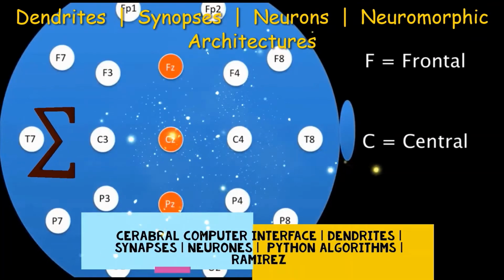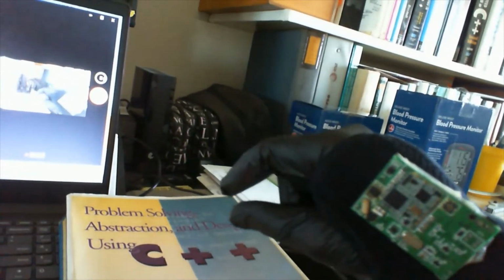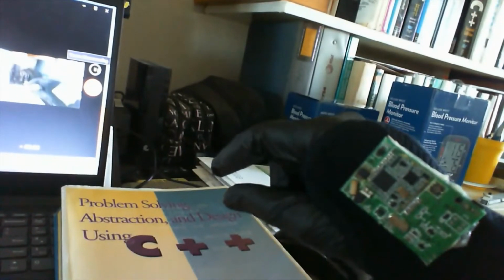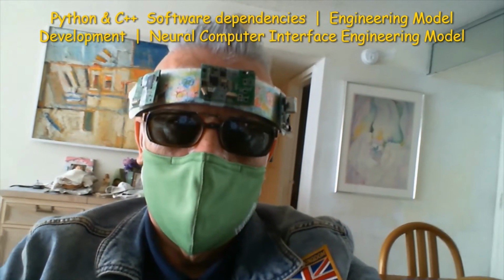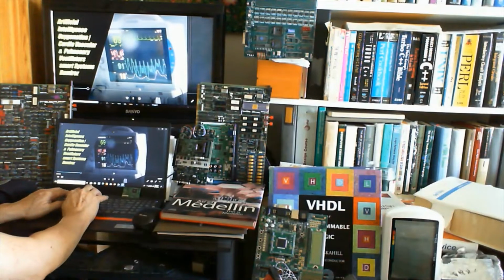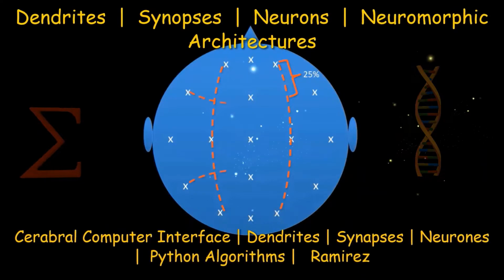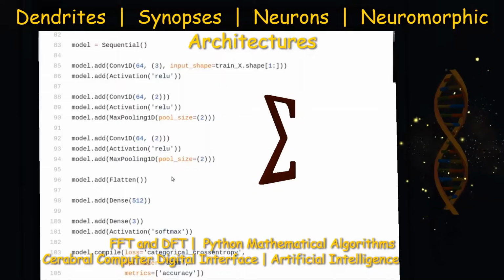To be precise, for a BCI that can recognize left hand movement MI versus right hand movement MI, the basic features extracted would be the average band power in 8 to 12 Hz and 16 to 24 Hz from both channels C3 and C4. So the EEG signals will be described and emphasized in only 4 features.